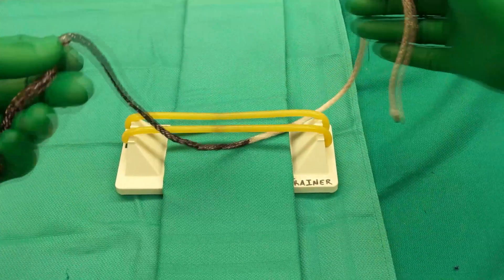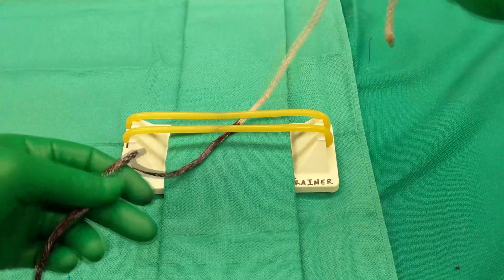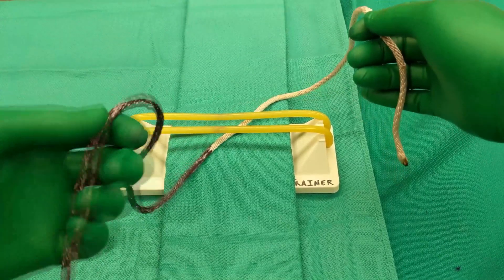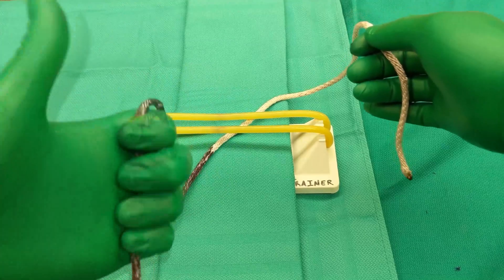Here's a technique for a two-handed tie. With a two-handed tie, you want to have your left hand closer to you, on the closer side, and your right hand holding the strand on the side away from you. Next, you want to get a fingertip grip on your left hand so you have good control.